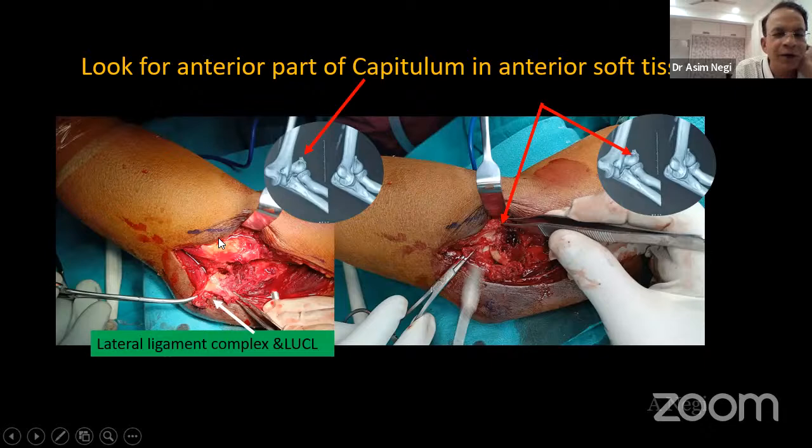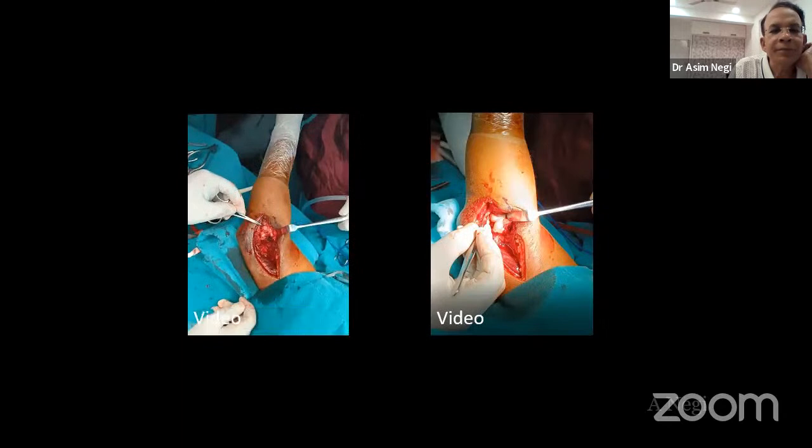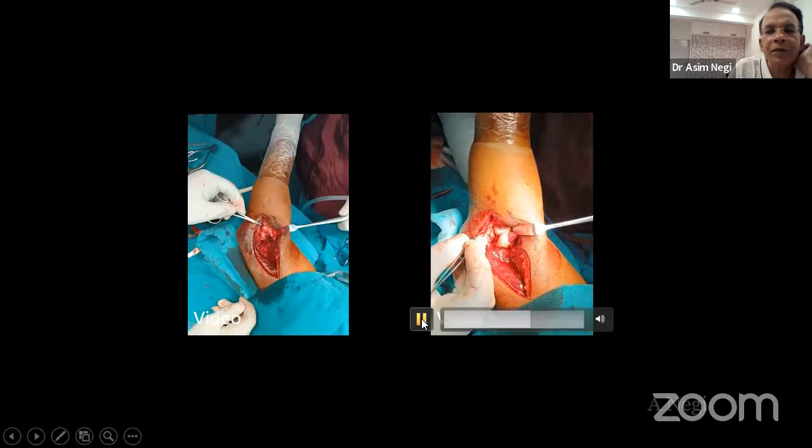The whole lateral ligament complex and the LUCL is seen here. The whole lateral complex is in this soft tissue. So just retract it, and you can have a nice, good view of the head radius. Yeah, now you can see the head radius.